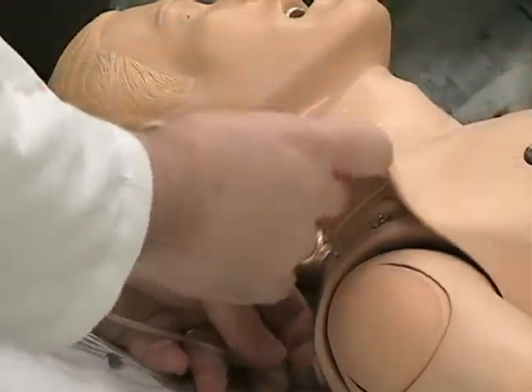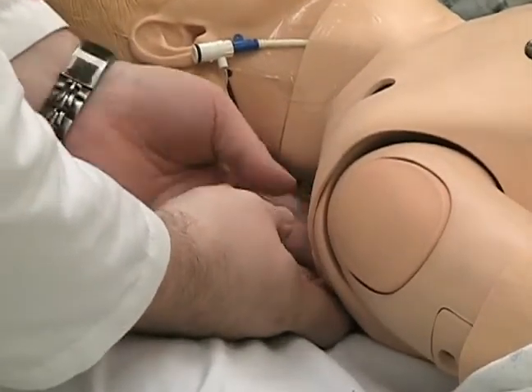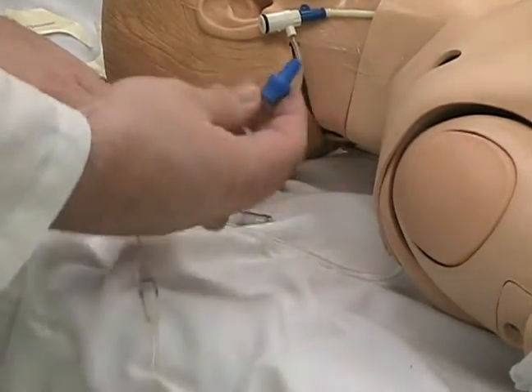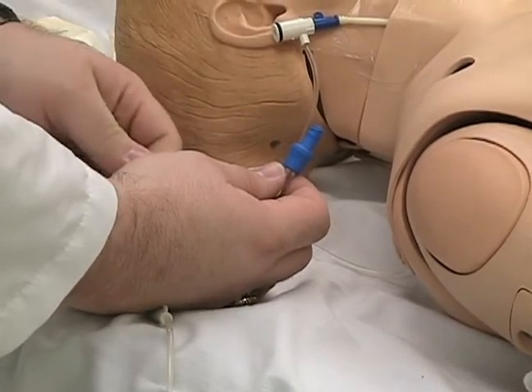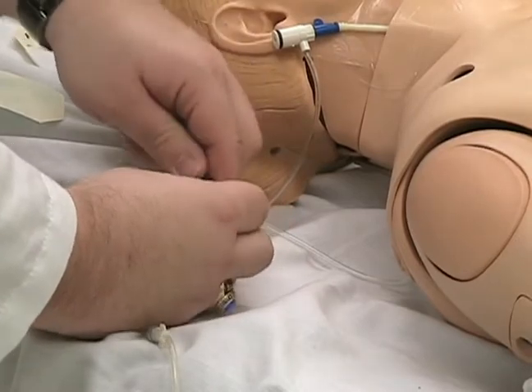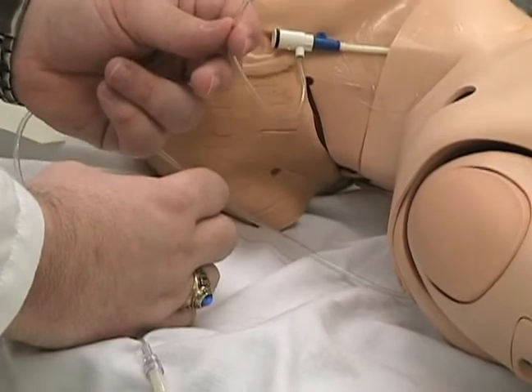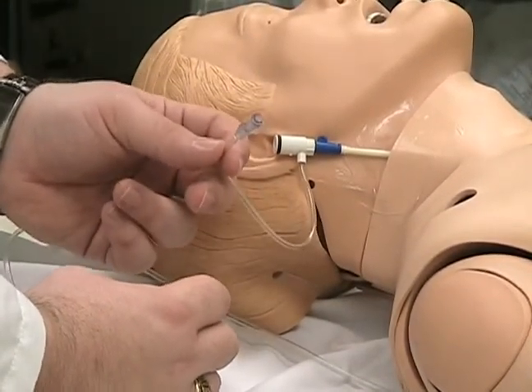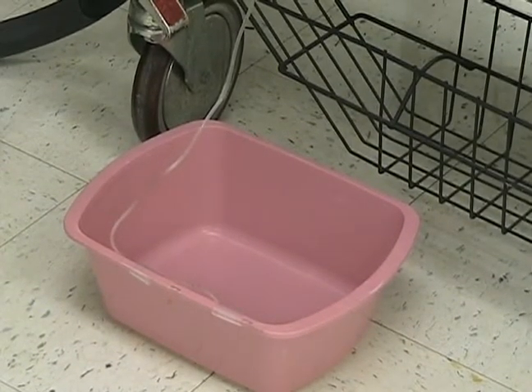Now we take the end of the adapter and run it down behind the shoulder of the mannequin, securing it underneath the flap of the chest skin. The end of this adapter will now be attached to the extension set from our IV fluid drain. Once attached, we run the extra tubing off the edge of the bed. Now this completes the circuit, and you may push your meds and your fluids through the neck. Now you have a complete circuit, and it will drain down to the basin below.